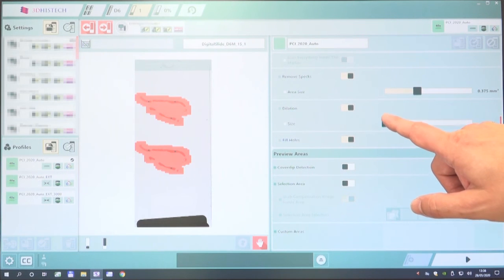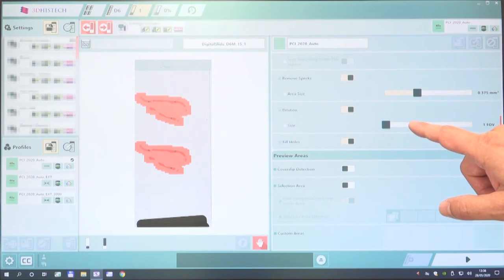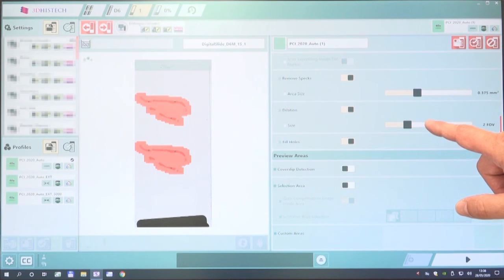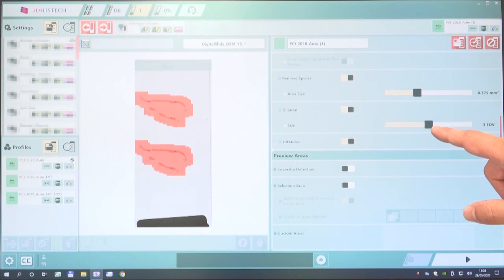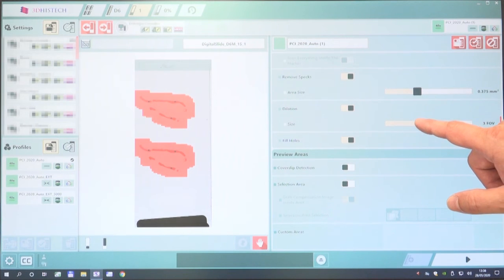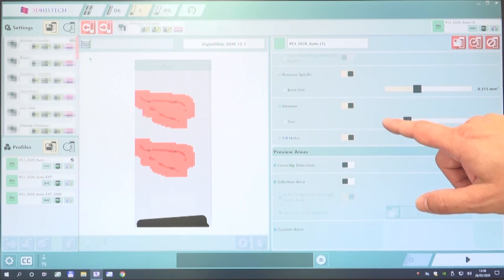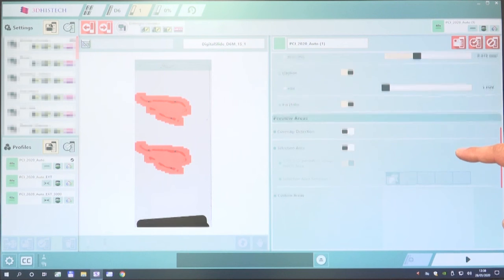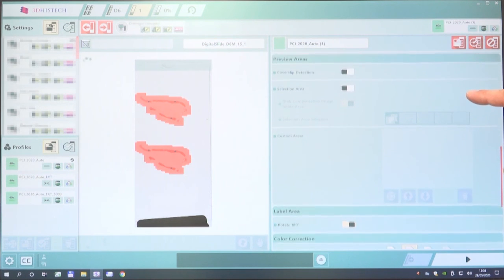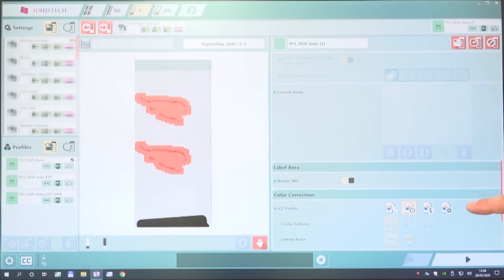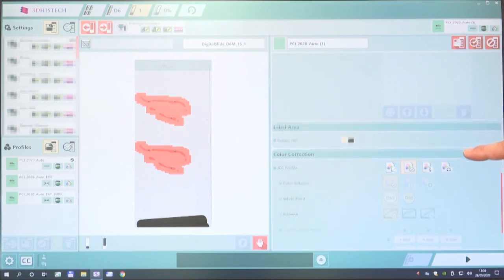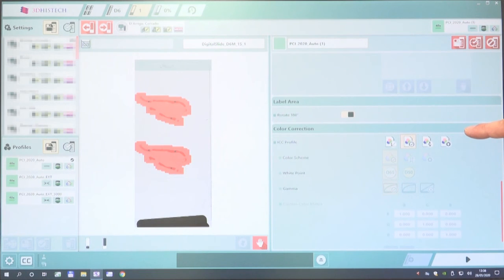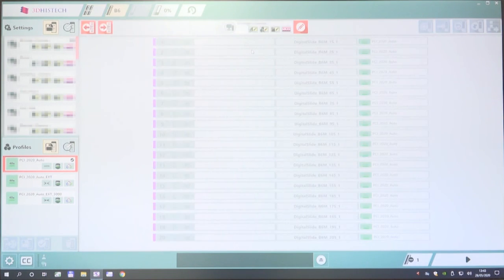If not, you can modify these settings and apply them as temporary profiles, or actually modify the original profile if you want to. But normally we just modify these as temporary changes, applying it to that one slide. So we can change color correction and other options as well.